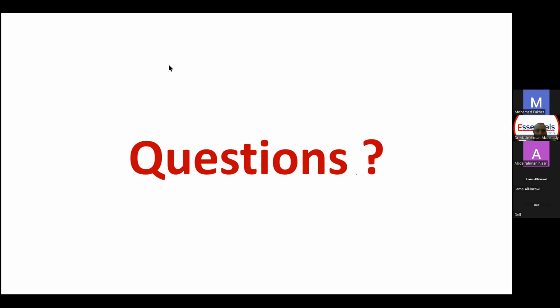The last question by Dr. Ahmed Fayed was asking if we have a misnomer of adaptive modes as they are called dual control. Yes. How is the real dual control mode defined? How can we define dual control mode? Dual control modes shift from pressure control to volume control in the same breath. That's the operating system of a dual control mode.